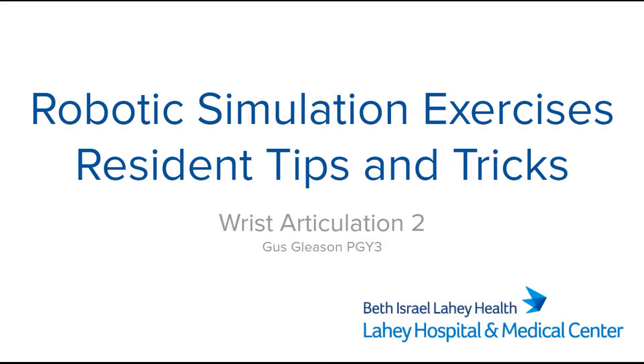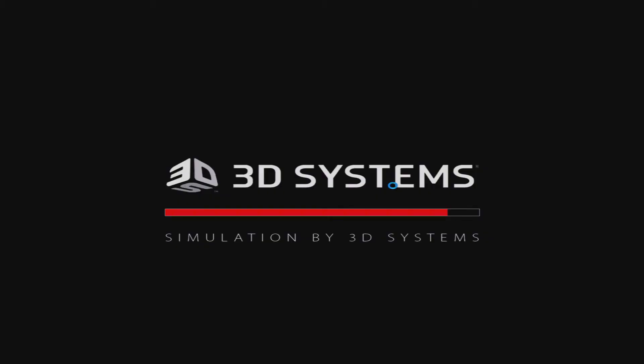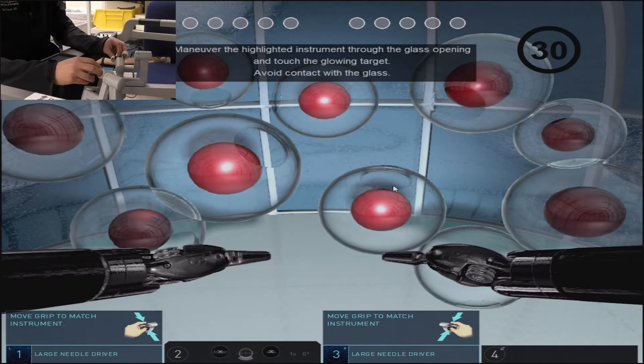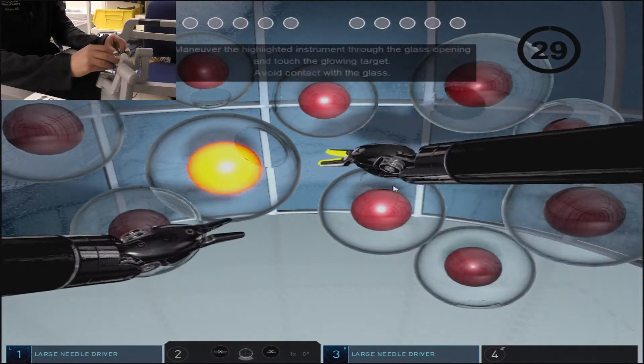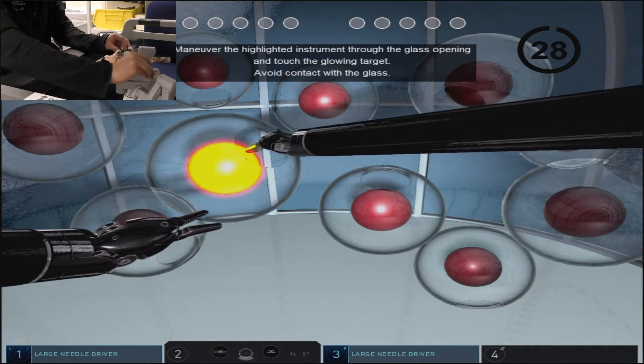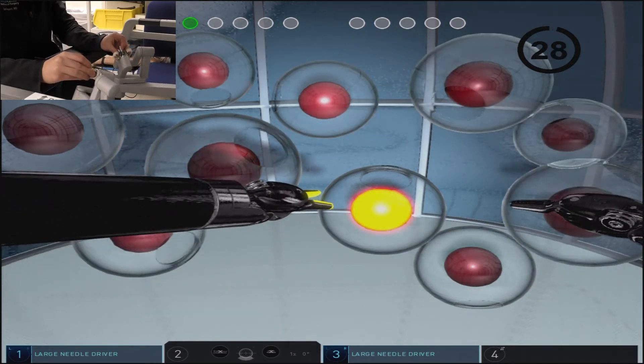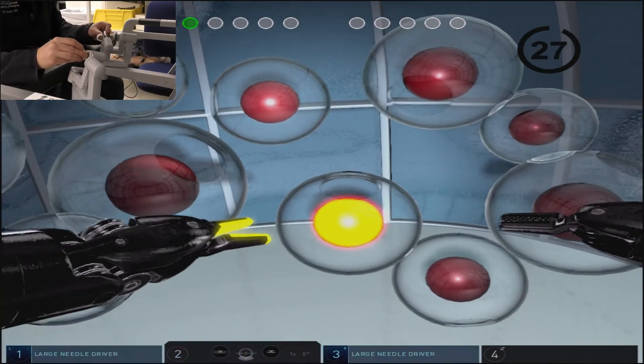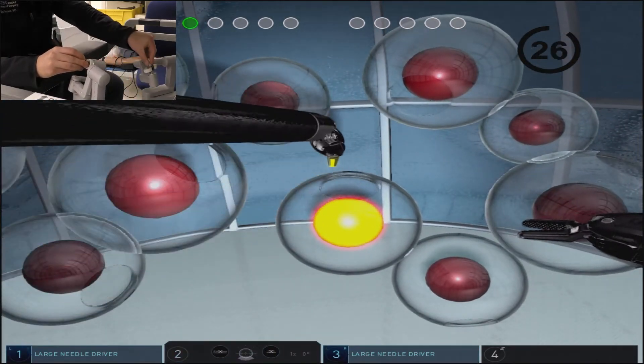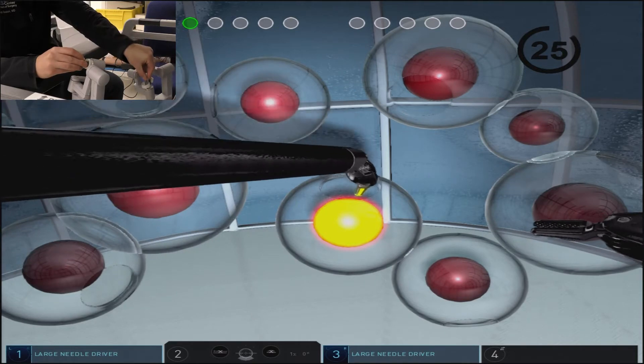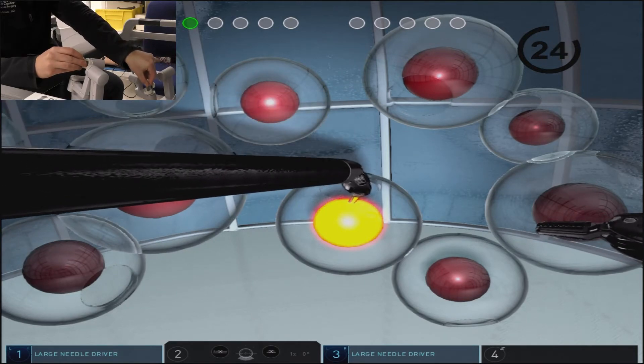Wrist articulation 2 is a much more difficult and practical version of the wrist articulation exercises. It presents you a whole entire visual field of spheres surrounded by glass globes which have openings at specific angles.